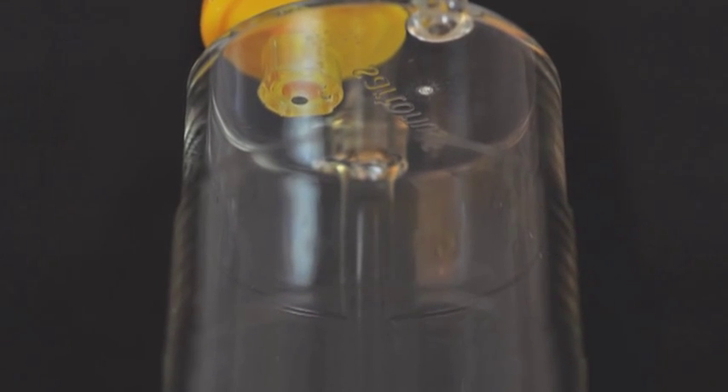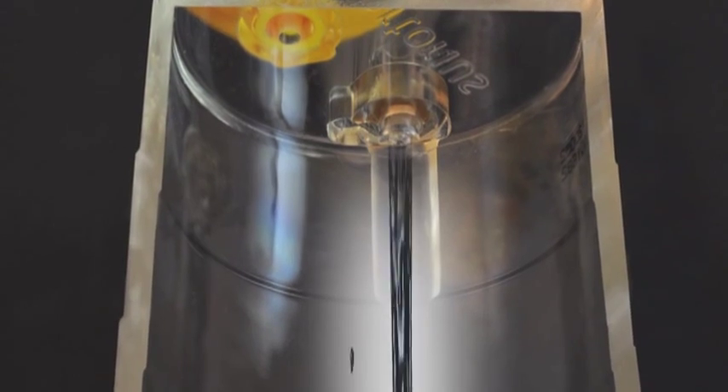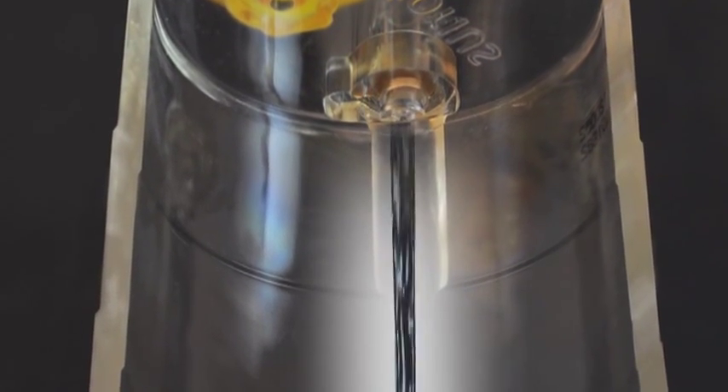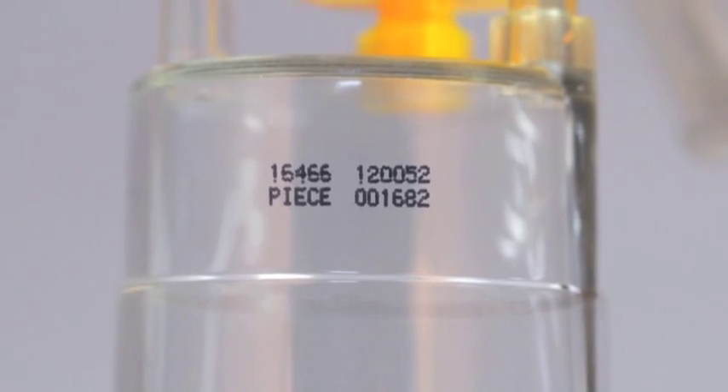A filtration channel allows fluid to enter the canisters without causing bubbles and aeration accumulating on the filter. Lot, product, and piece number are also indicated on the canister.